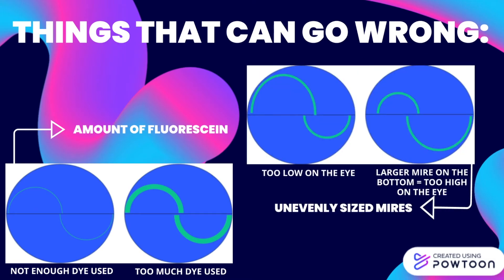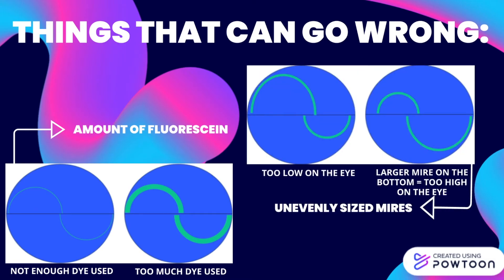Thicker lines can be caused by an excess amount of fluorescein and will overestimate pressure, while thin lines indicate not enough dye and can underestimate pressure. When the prism is placed on the cornea slightly off-centre, this can create mires of unequal sizes. When there's a larger mire on top, you're too low on the eye and need to move up. When the larger mire is on the bottom, you're too high on the eye and need to move lower. In short, you need to move towards the direction of the larger mire.